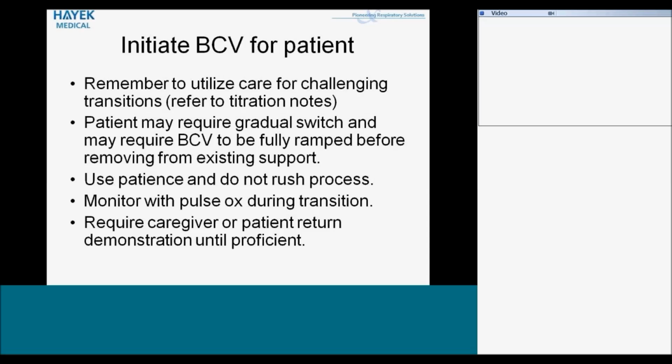Once you've done the transition and you've got the patient moved over, then that transition has to be return demonstrated by caregivers for the patient. It's something that you want to make sure that they are able to duplicate. So once you determine the steps in the process, and you're working through that with the caregivers present, have the caregivers return demonstrate, because the patient may continue to use their non-invasive or their invasive positive pressure support on occasion as backup and have to transition back and forth. So the caregivers need to know how to do that.